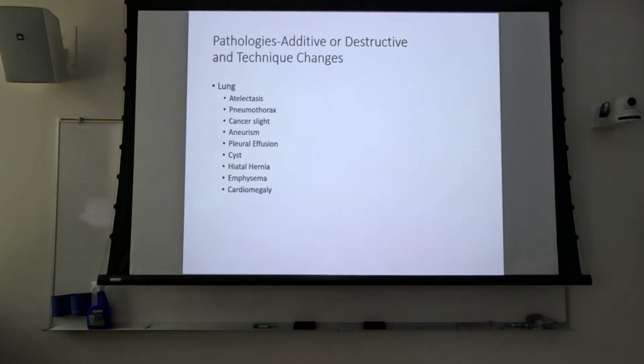If you get to a test and you can't remember whether it's kVp or mAs, go with mAs. If it's bone, okay, kVp, but if it could go either way, go with mAs, because 90% of your changes are going to be mAs.